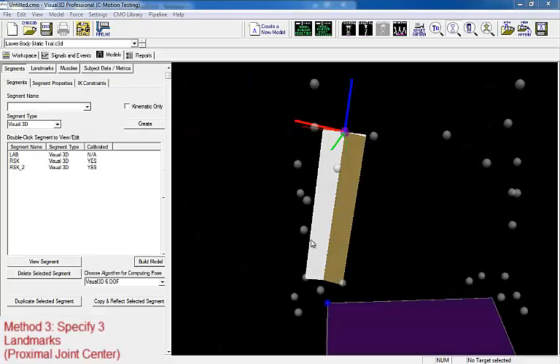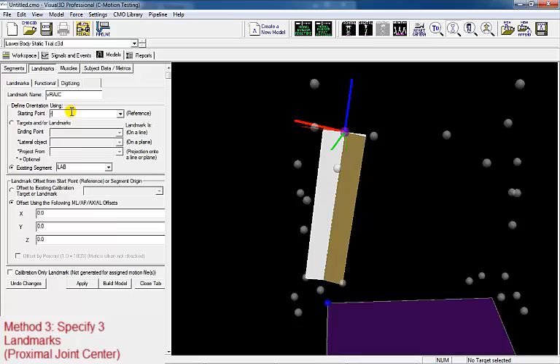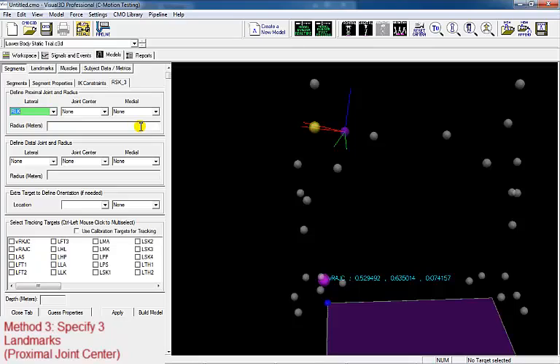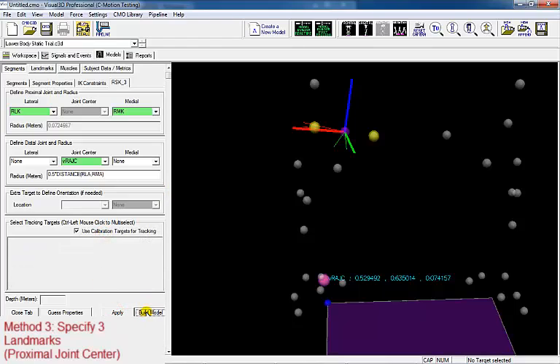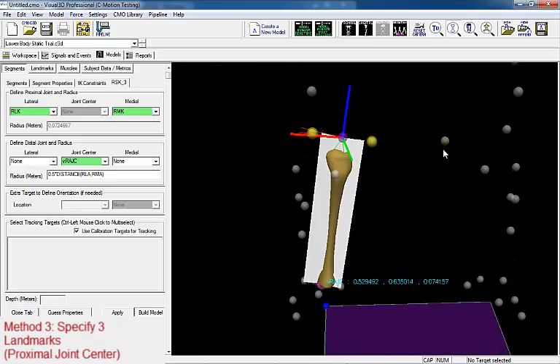For shank 3, we are going to use the same method as right shank 2, except we are going to use the ankle joint center instead of the knee joint center to define the anatomical plane. We will use the lateral and medial knee markers to define the proximal end. We will define the virtual ankle joint center as halfway along the line between the medial and lateral ankle targets. Our virtual landmark will appear in purple. We can now define our third shank segment using the medial and lateral knee targets for the proximal end, the virtual ankle joint center for the distal end, and an equation to define the radius. Use calibration targets for tracking. You can see the x axis is now defined along the line between the two knee targets, and notice this axis is internally rotated compared to the original shank segment, since the first segment was defined between both medial and lateral ankle and knee targets.